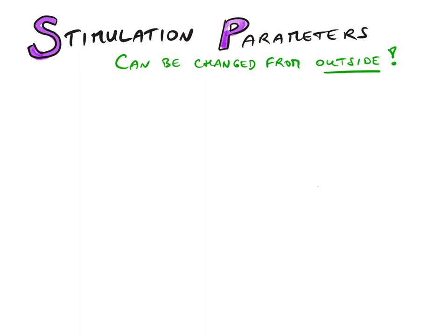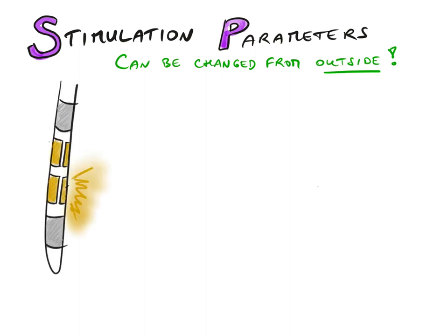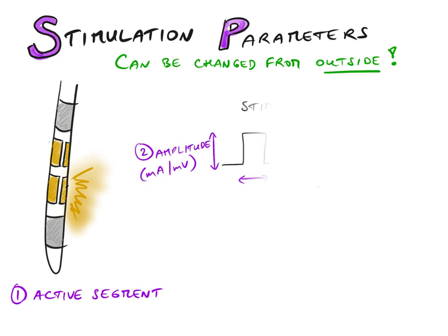It's not only about directional steering, you have more options. So again, the active segment is the first thing you choose. MER can help, the MRI helps. Still, it remains to some extent trial and error. So in each patient, you have to find the optimal settings individually. And you not only try to choose the best active contact or segment, but you're also concerned about how much current, milliamps, millivolt, can we give. Obviously, if you stimulate too low, then you don't get effect. If you stimulate too high, you get side effects, and you try to have the maximal window between getting effect and getting side effects, for which directional steering is very important, very helpful.